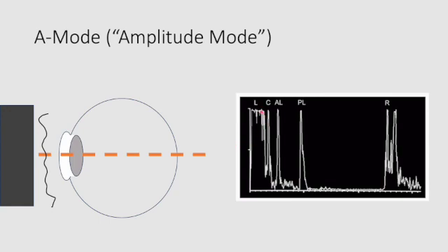And what we see here is that we get reflection peaks of different amplitudes, with the highest referring to the areas where there's the most impedance of the sound wave. So if we remember, impedance is generated not only by the structures that the ultrasound wave is passing through, but it's generating echoes at each of those structures' boundaries. So we have the skin here, and there's all sorts of boundaries inside the skin and soft tissue, so we get lots of echoes here.